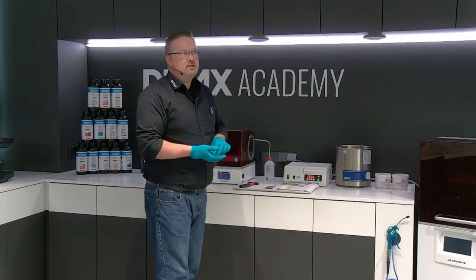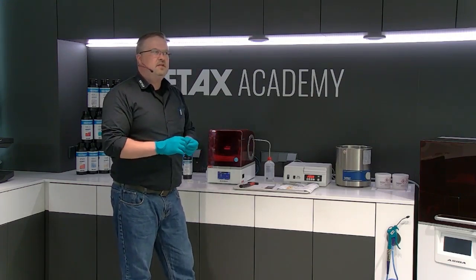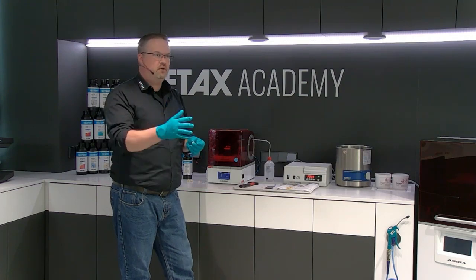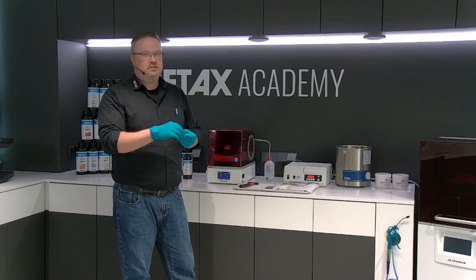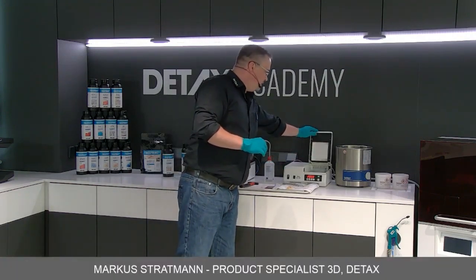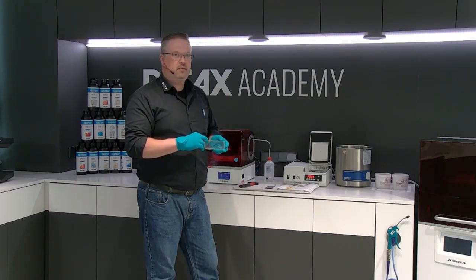Now we need 30 minutes. Leave the material on the table or wherever. This is the time to make sure that the rest of the isopropanol alcohol goes away completely from the surface and from the material. We need 100% dry crowns to get a perfect result. And now we use the N360 box from NK Optics.